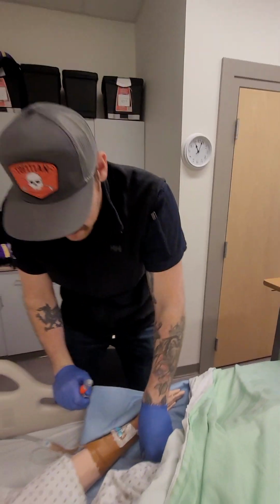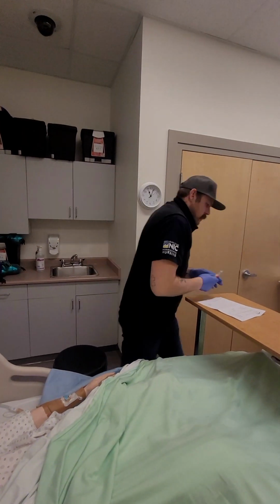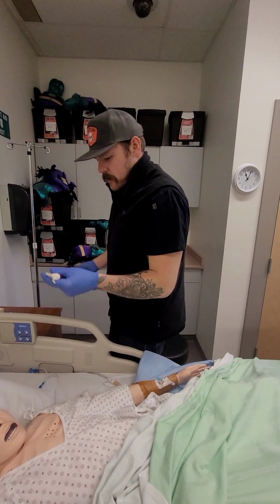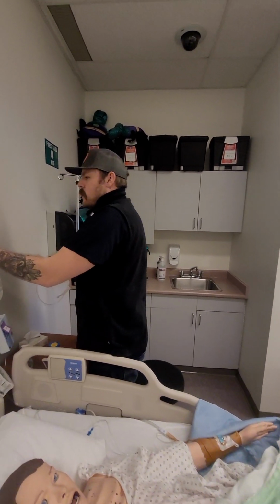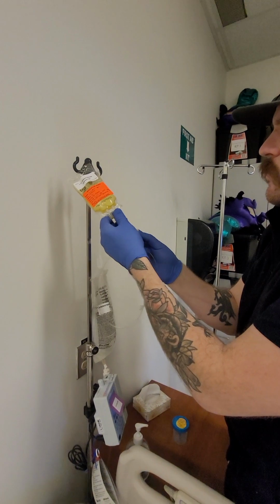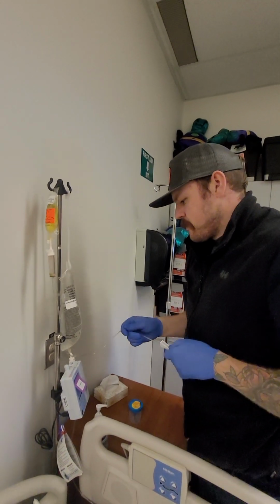That line flush is great. I'm going to get rid of this just so we don't put any hazards here. We're going to put it in the garbage. And we're ready to hang your line. So what I'm going to do is I'm going to piggyback fill this tubing. We know that this comes out of a sterile container. We know to take this off, it's going to stay sterile as well. We're going to pop that in here and make sure this line is clamped.